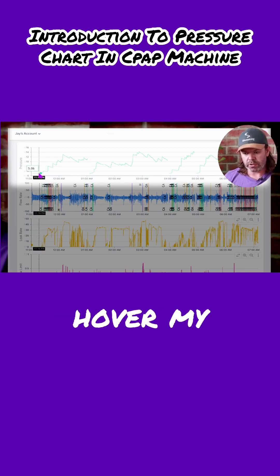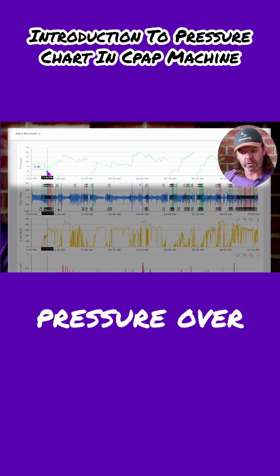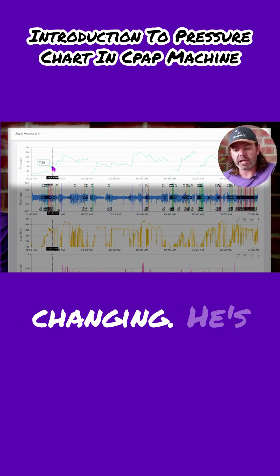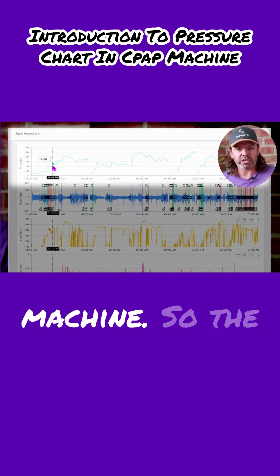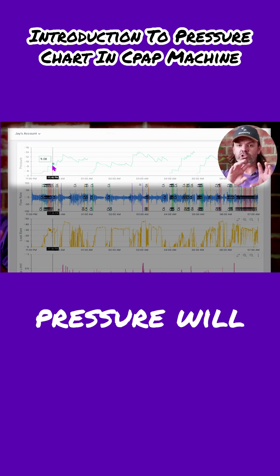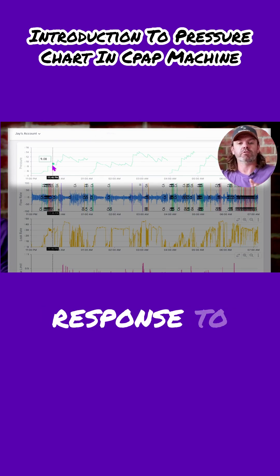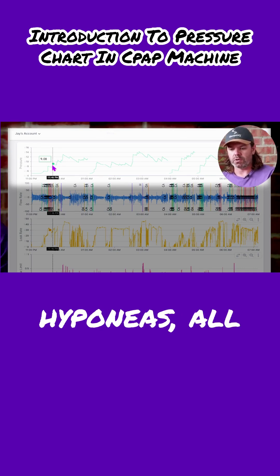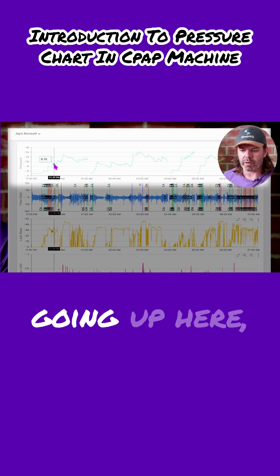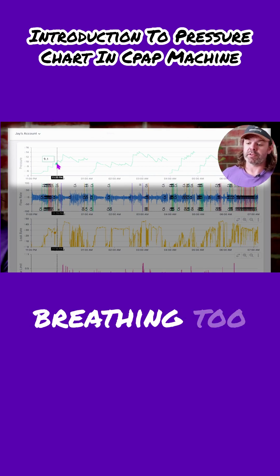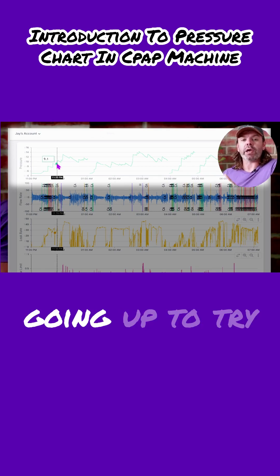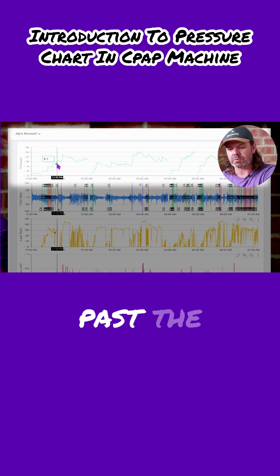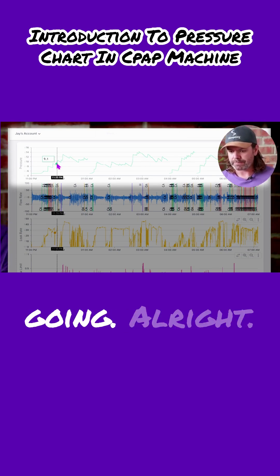If I hover my cursor over the pressure — the green line here — this is the pressure that's changing. He's using an automatic machine, so the pressure will change over time in response to how Jay is breathing: apneas, hypopneas, all that stuff. You can see it's going up here, which normally means he's not breathing too well, and the machine is going up to try and force more air into his lungs, force air past the blockage and get his breathing going.